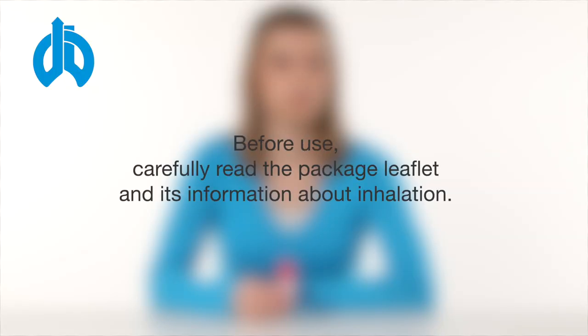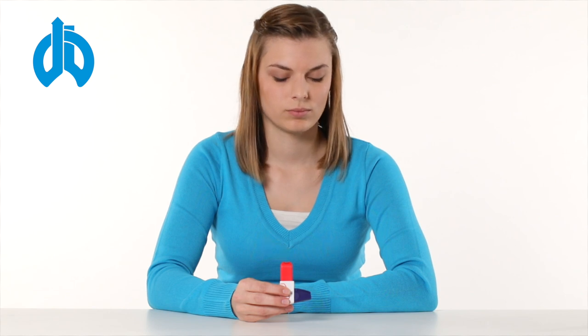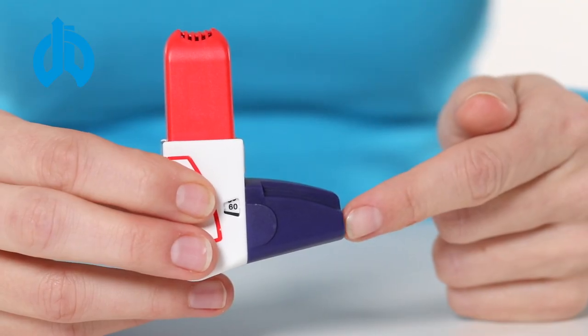Important information before use: carefully read the package leaflet and its information about inhalation. Keep the inhaler in its packaging until you want to use it for the first time. The Easyhaler is equipped with a protective cap which prevents accidental actuation of the inhaler.